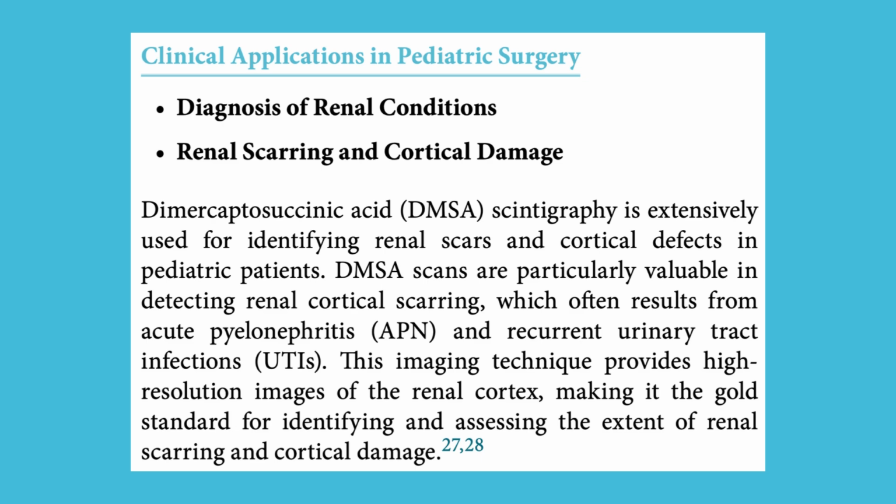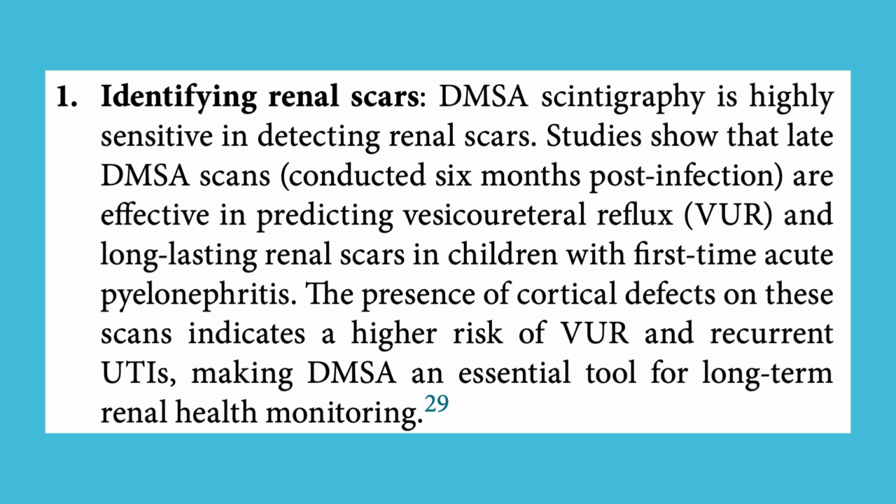This imaging technique provides high-resolution images of the renal cortex, making it the gold standard for identifying and assessing the extent of renal scarring and cortical damage. 1. Identifying renal scars. DMSA scintigraphy is highly sensitive in detecting renal scars. Studies show that late DMSA scans, conducted 6 months post-infection, are effective in predicting vesicoureteral reflux, VUR, and long-lasting renal scars in children with first-time acute pyelonephritis.